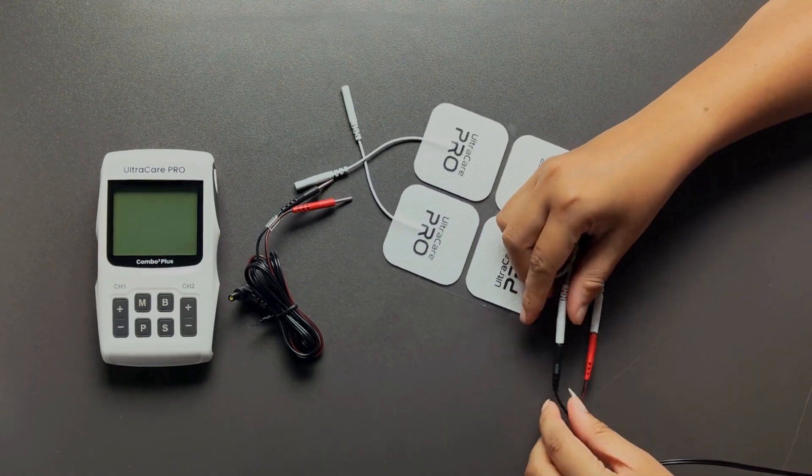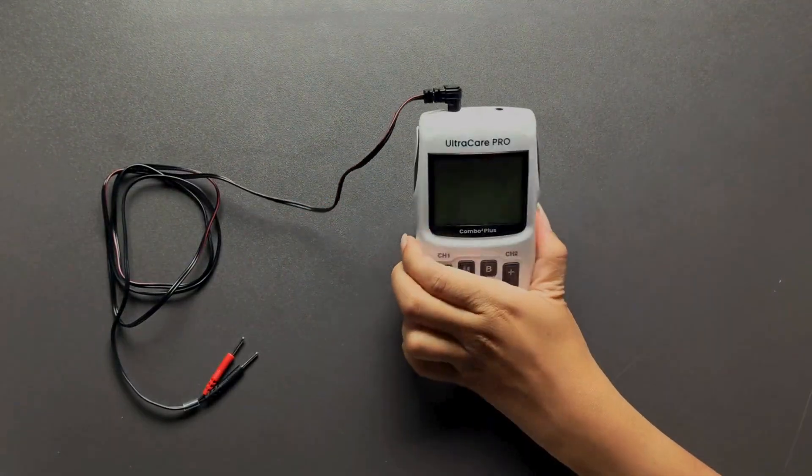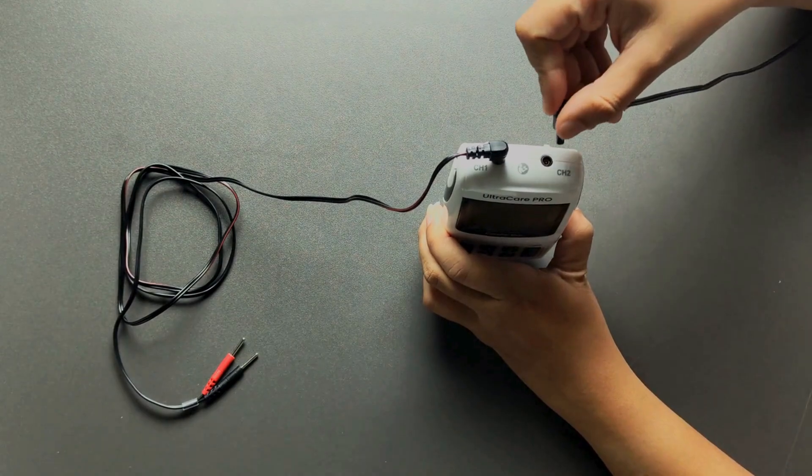First, connect the pads and the lead wires. Insert the lead wires into the electrodes and then plug them into the combo unit.